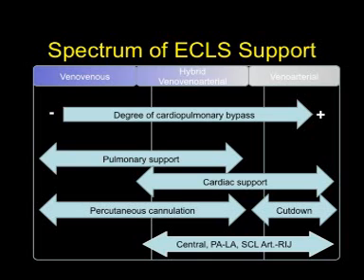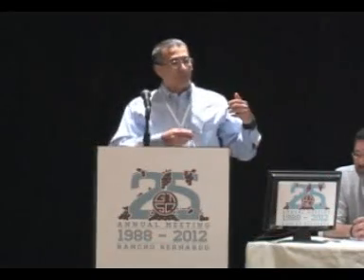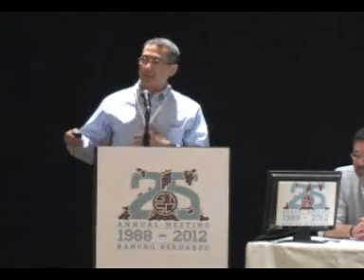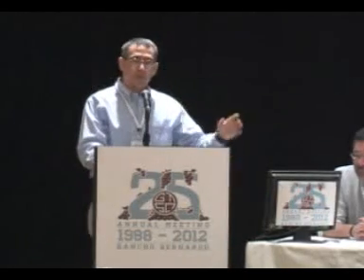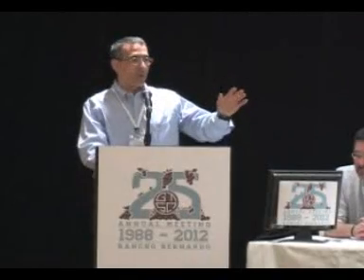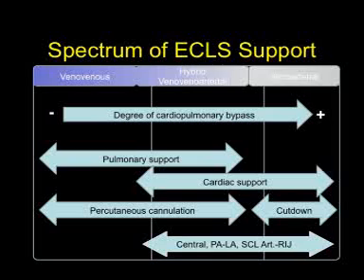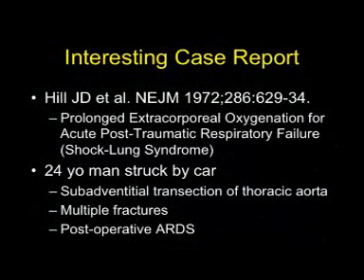So, there's a spectrum of extracorporeal life support, all based off of cardiopulmonary bypass. And we have veno-venous, a veno-venous arterial hybrid, and strict veno-arterial. You can also do AV approaches. But it depends on whether you're looking primarily for pulmonary support or cardiac support or some blend of that. And of course, there are different approaches. The central approach, whether you use a PA to LA, where you're using the right heart to provide the pump. You could also use a right IJ for venous drainage, and then a subclavian artery approach with a graft on that. So let's start with the interesting case.